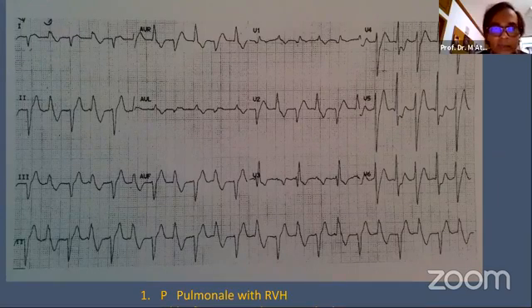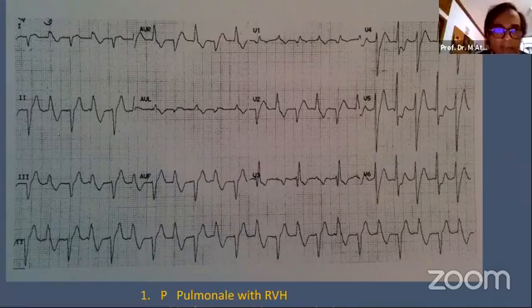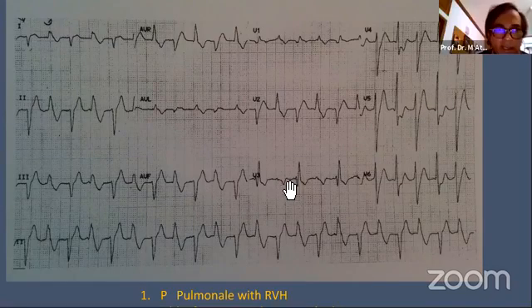If we search from lead 1 to lead V6, please look at V3. There is something else. So this may be one evidence that this sinus node is working. And if this is true, also in V4. So the complex following it is the conducted QS beat, that is the sinus beat.